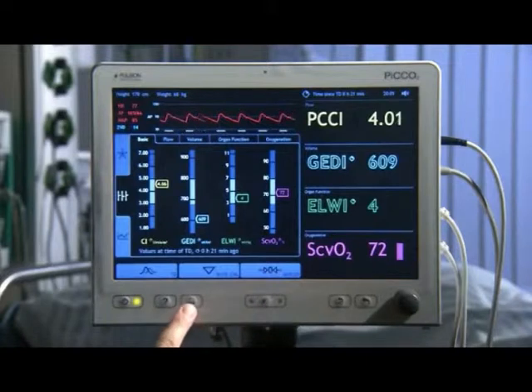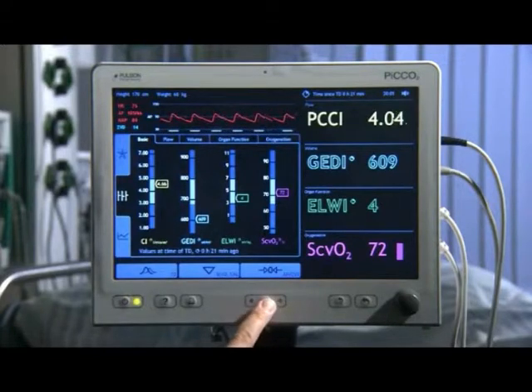The print key is used to start the paper printout or export the data to a USB storage medium as a PDF. In the middle is the mute key. This allows the alarm to be silenced for 2 minutes. During this time, the key lights up orange.